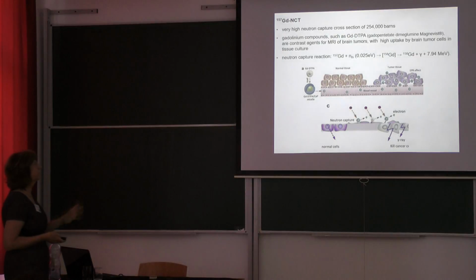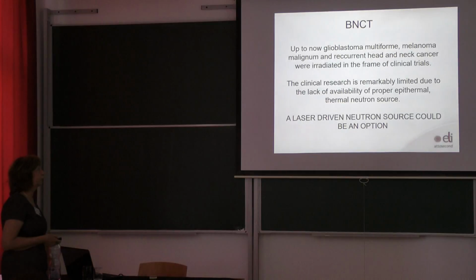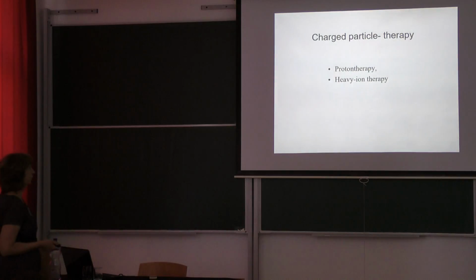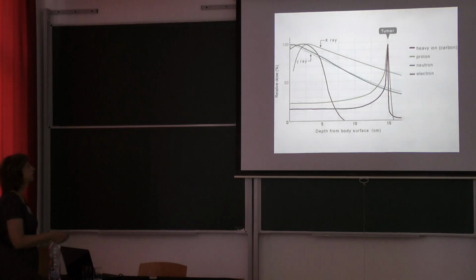And there are several other considerations with gadolinium neutron capture, but finally boron neutron capture therapy has been used in the clinic with BPA, borophenylalanine, and borocaptate for glioblastoma multiforme, melanoma, and recurrent head and neck cancer, and for nothing else. But the charged particle therapy has been much better developed with proton therapy and heavy ions.